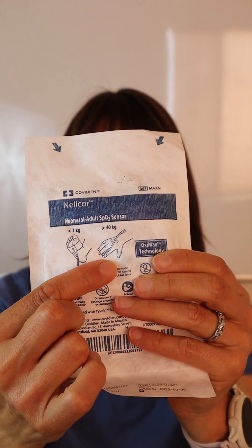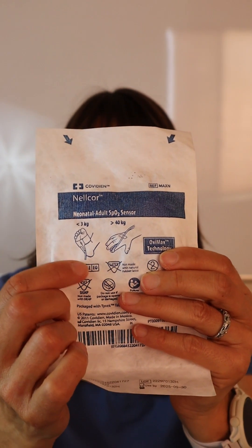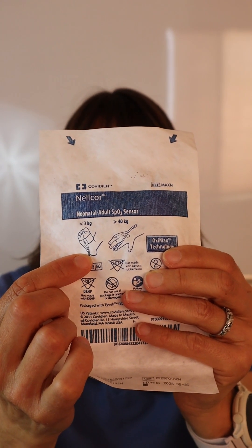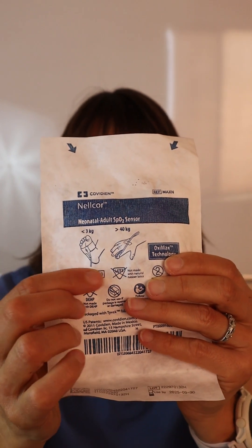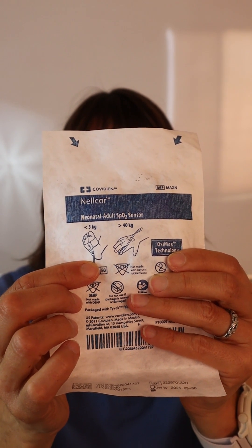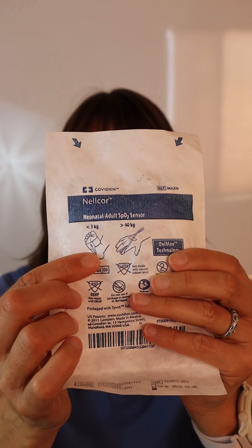Remember a toe is always another option, or you could use this for small children or infants and wrap it around their entire foot. Instead of shining through the finger only, it shines the light through the patient's foot — the same technology as a normal pulse oximeter to give you a good reading, but this only works on very small children and very small feet.